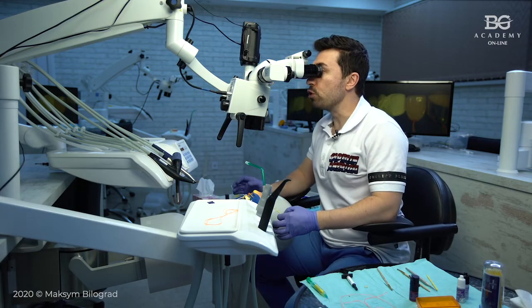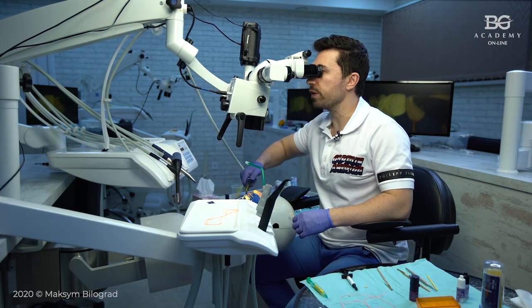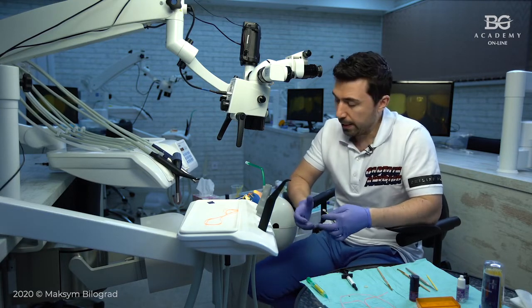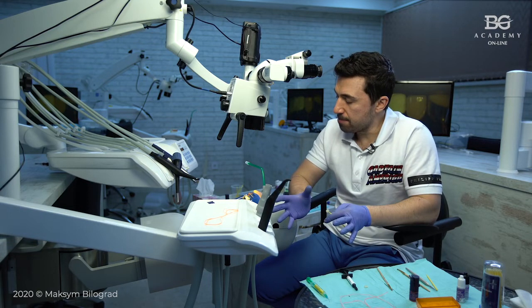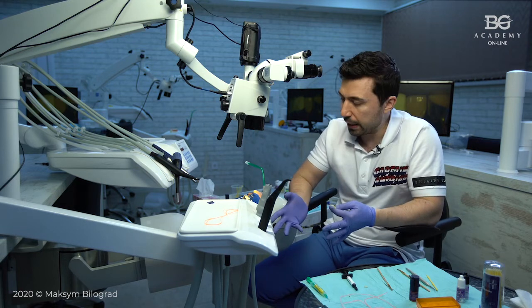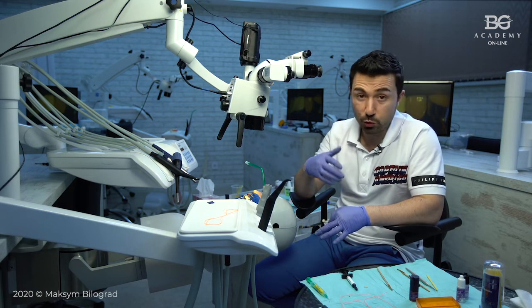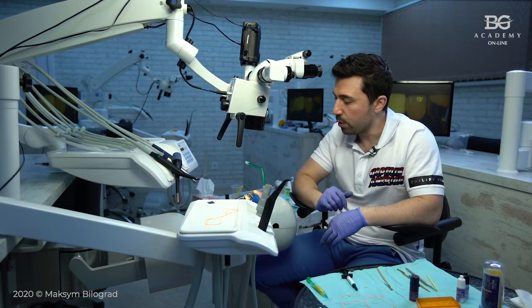Why are we not light curing adhesive on the surface of the veneer and also on the surface of the tooth? Because, for example, if you are using a thick adhesive like Optibond FL, which is pretty thick and filled, it may compromise the fit of your veneer. If you use a thin adhesive and dry it, actually you can light cure, but still some adhesive can go between the matrix and the tooth, between the Teflon and the tooth, and if you are not able to see it precisely and then light cure, you may again get some compromise with the fit of your ceramic veneer.